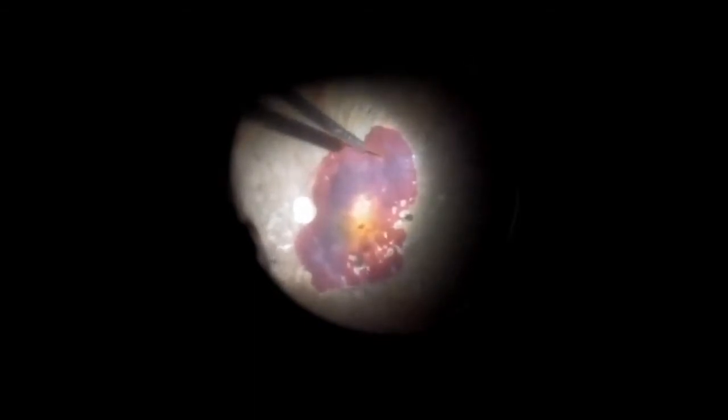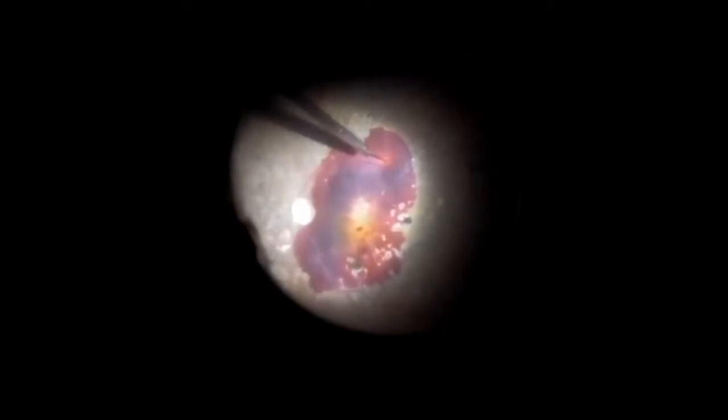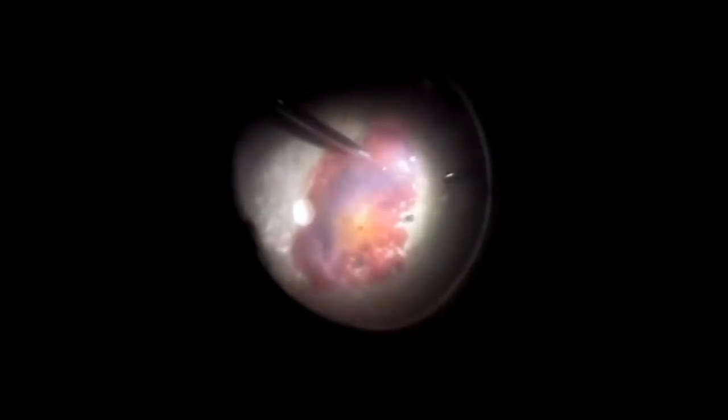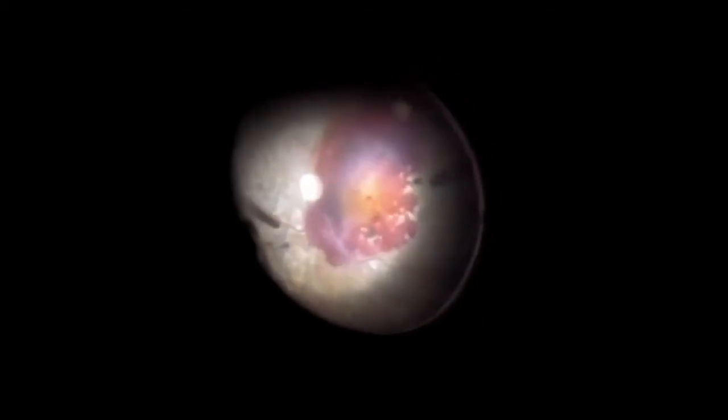Next, a 39-gauge infusion cannula is used to enter the subretinal space in an eccentric location. Automated infusion of the tissue plasminogen activator is used to create a macular detachment. To ensure that TPA has migrated to include the entire area of submacular hemorrhage, a second inferior entry was created.